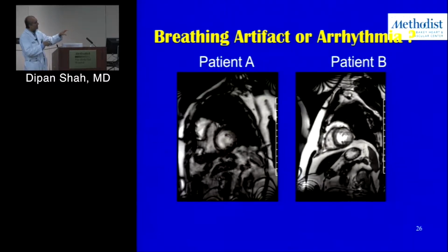So in this case, the person's not holding their breath, and all these abdominal images look blurry, as well as the cardiac images. The other thing also is if you look at the image, what about even end diastole, the very first frame? Does it look normal or blurry? It looks blurry. Everything looks blurry.